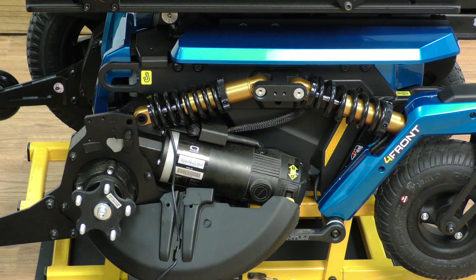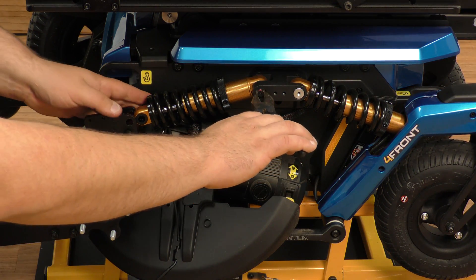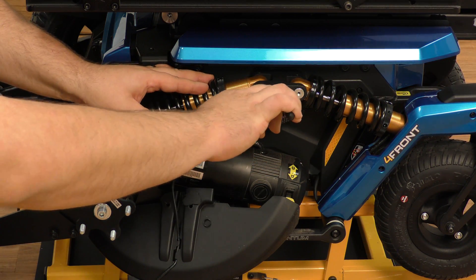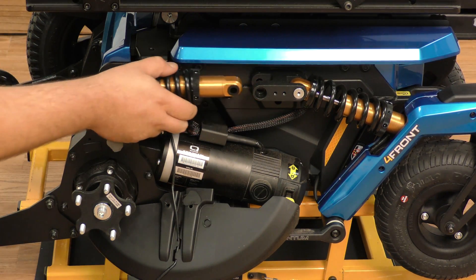The motor will actually fall down a little bit — that's okay at that point. From there, we remove the Allen head again and repeat on the top. Then you can pull the strut right out.